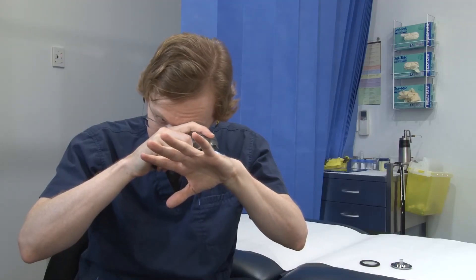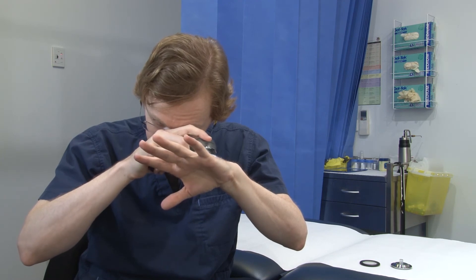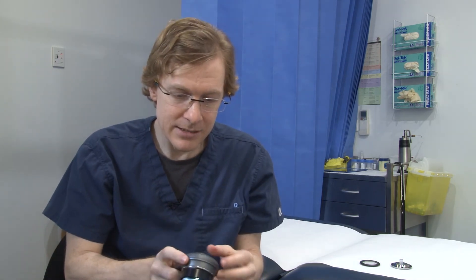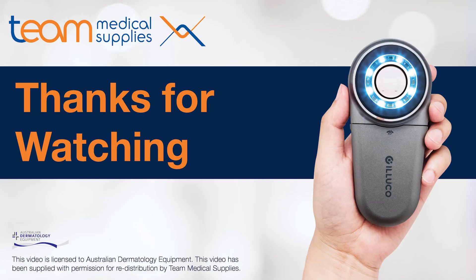And then when you look through the eyepiece, it's quite a wide view on it. So I've been really happy with this and it's done a really good job. Thank you very much.